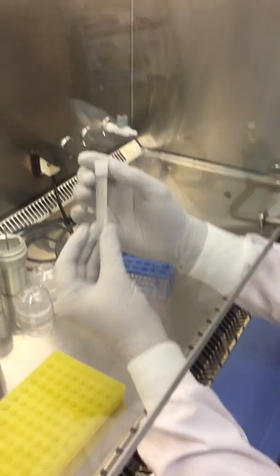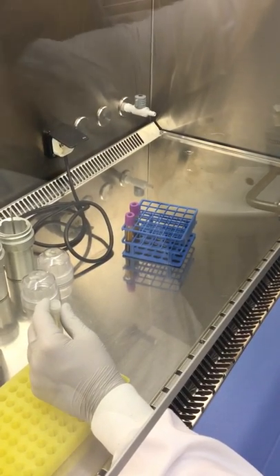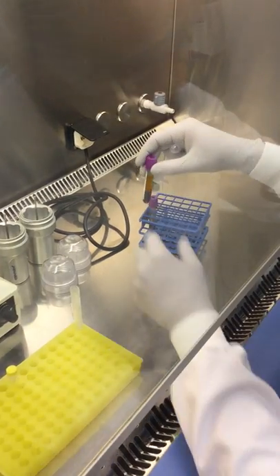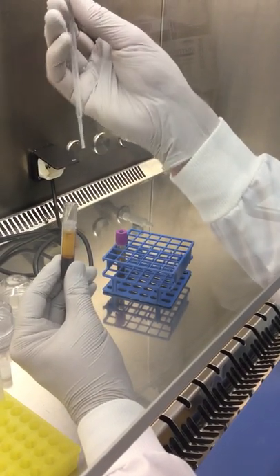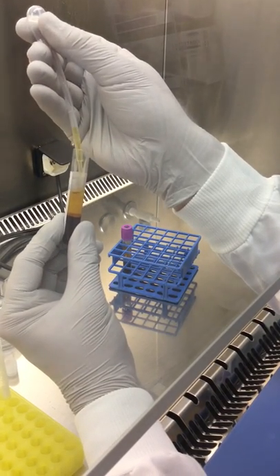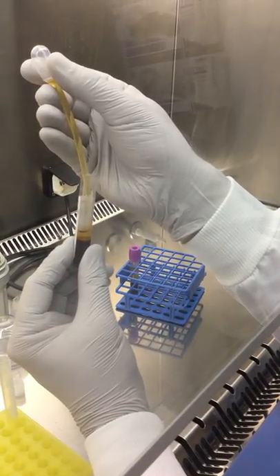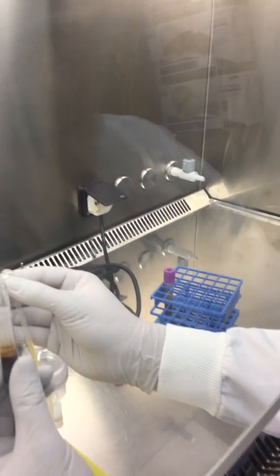First of all, we have the larger tube. This is going to be for our plasma. When drawing the plasma off of the top, you've got to be very careful not to disturb the Buffy Coat layer. It's just going nice and slow. You can leave about that much if you want to, about half a mil there.